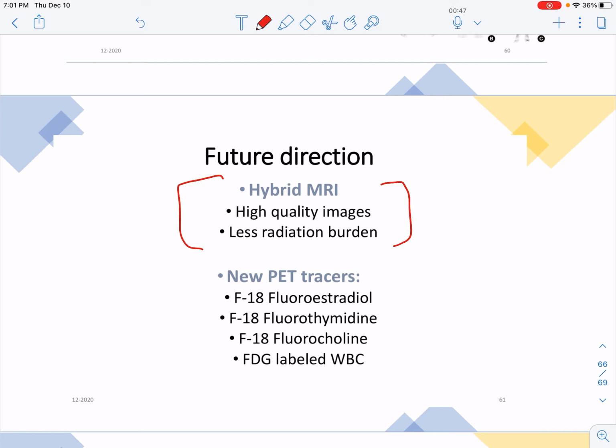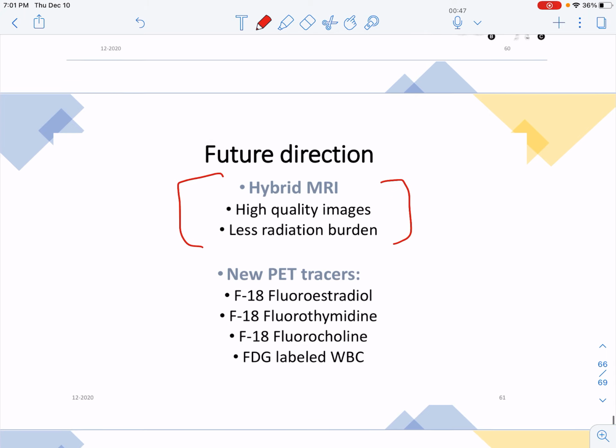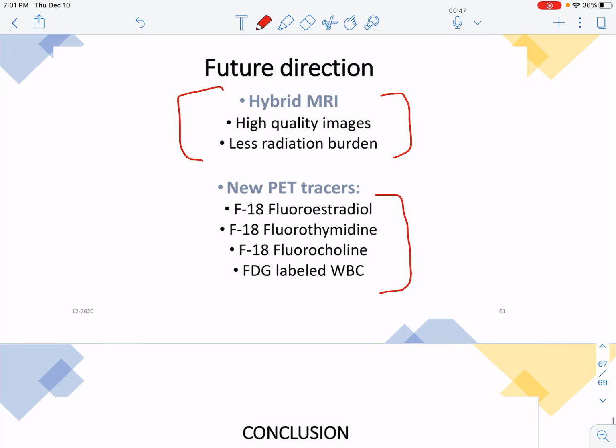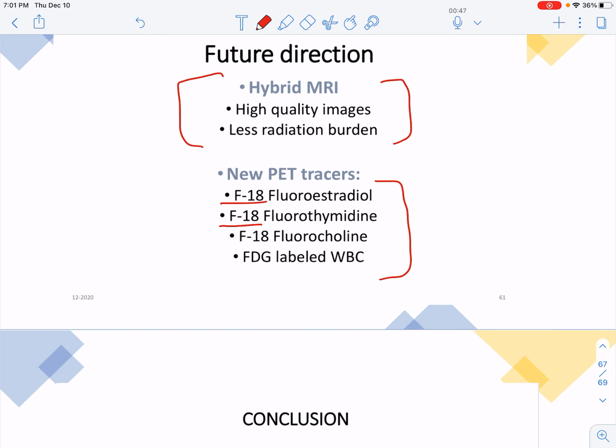Actually, many have done it already, even at MGH, but now they are working on the research. For a few years they worked on animals, but now they have started working on actual patients. And this is a new tracer for PET. As you notice, PET tracers are all fluorine. Here is another tracer, but on bone scan we are using the fluorine.